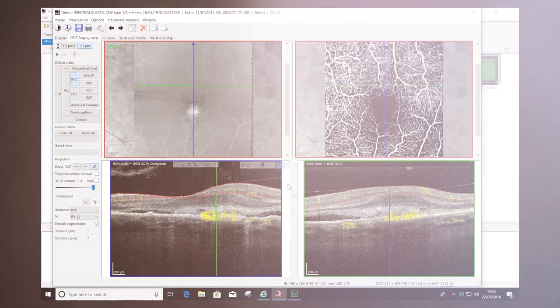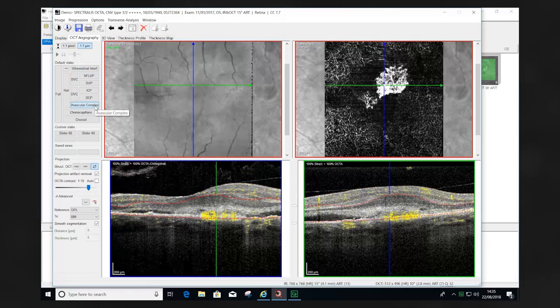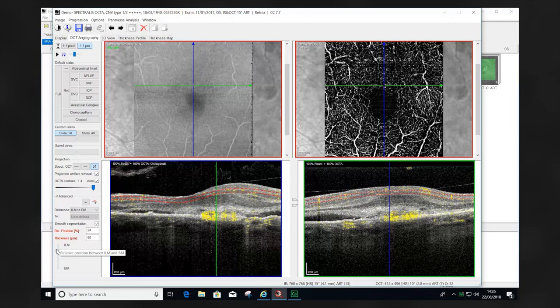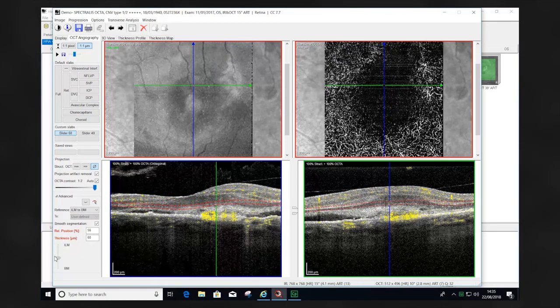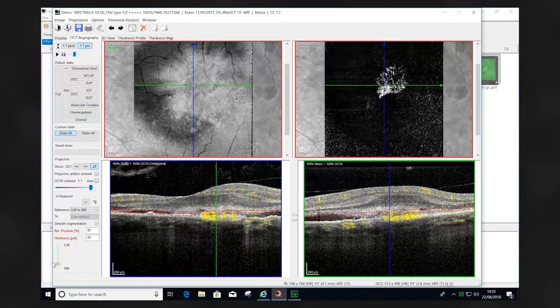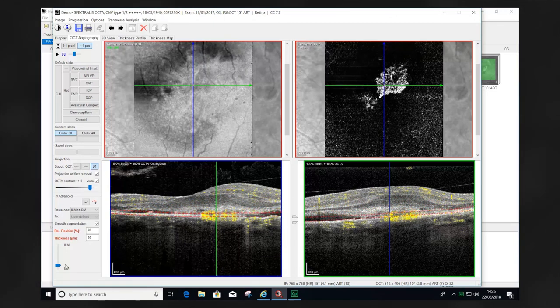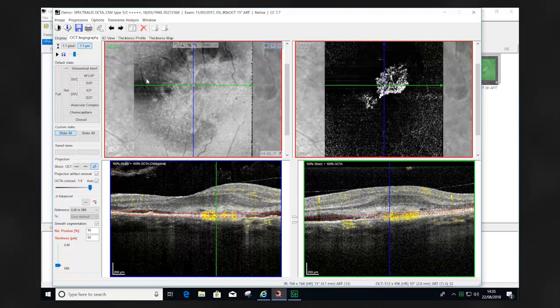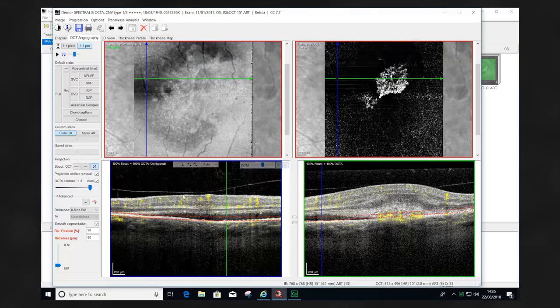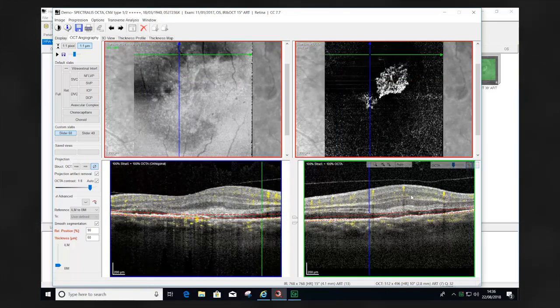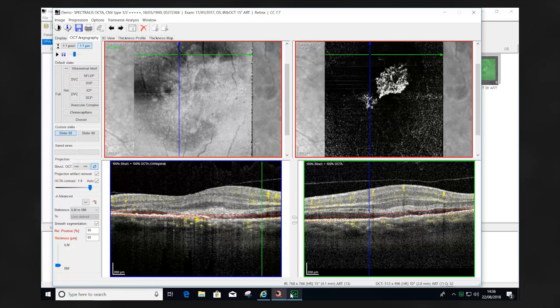Having identified where the areas of increased flow are, we're now going to use co-localization to identify areas of subretinal fluid. This is important as it may identify areas of recent activity. The abnormalities within the top left enface image enable us to localize the subretinal fluid in the bottom right image. The top left image on face shows abnormality which is co-localized bottom right to the subretinal fluid.